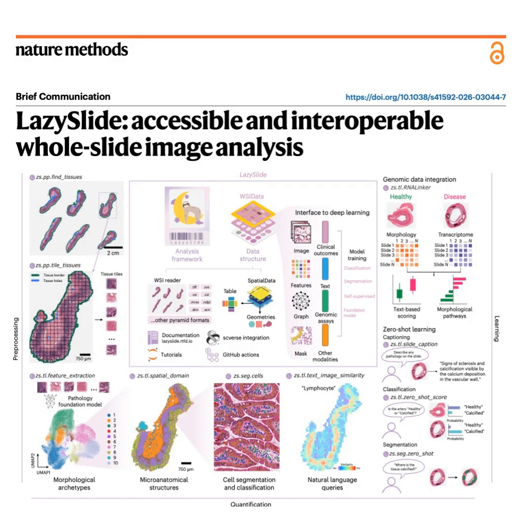This raises an important question. What is the catch? Where's the structural bottleneck? Well, the interoperability with the scverse ecosystem is LazySlide's biggest strength, but it dictates the strict use of the ZARR file format. ZARR. That's a format that stores n-dimensional arrays in compressed, chunked files, right? It allows for that lazy loading we love. Right. But the cost is realized in high-performance computing environments.